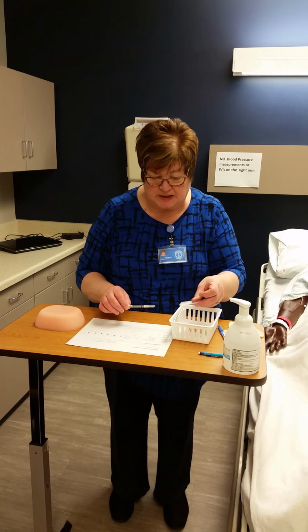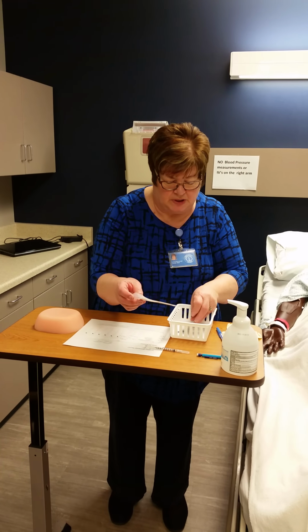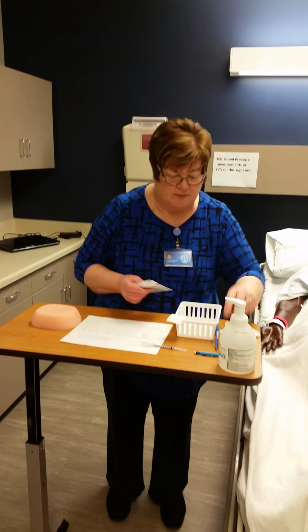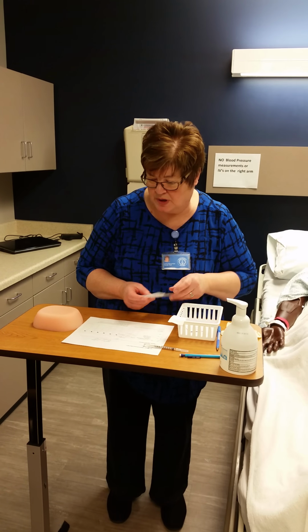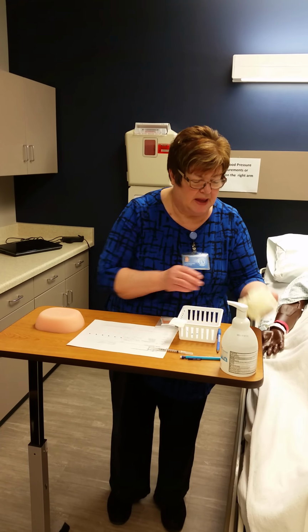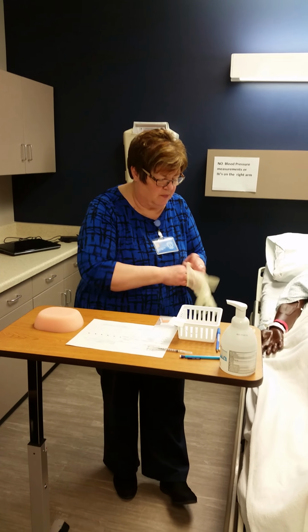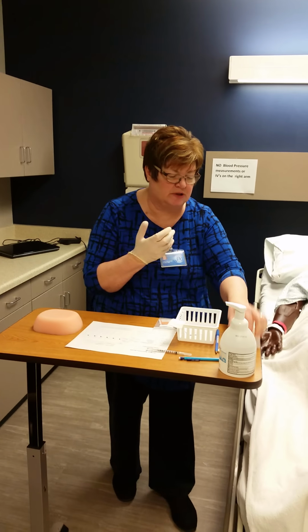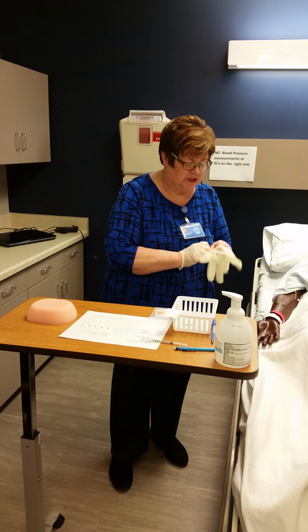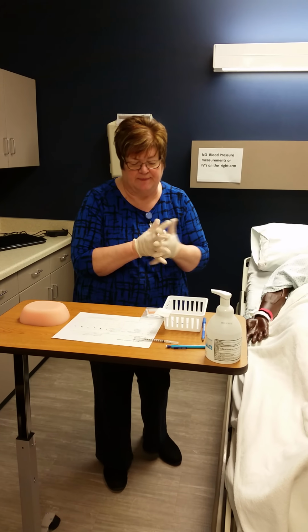Okay, so I'm going to set that aside for right now. I've got a piece of gauze here if I need one at the end. I have a marking pen to go around the site after we've given it to Casey. And so I'm going to put some gloves on. And what the instructor will do is she's going to give you her arm, and she's going to have you determine where on that arm you're going to be giving the injection, okay?